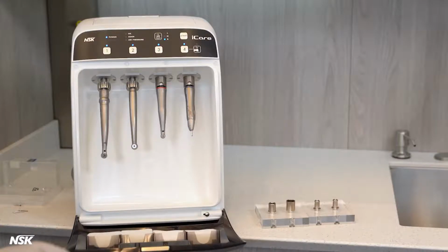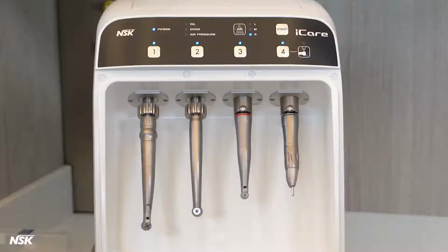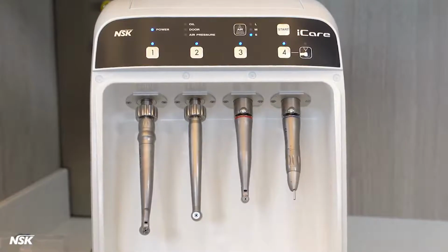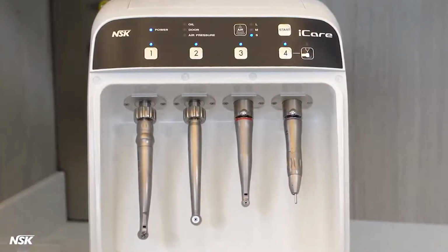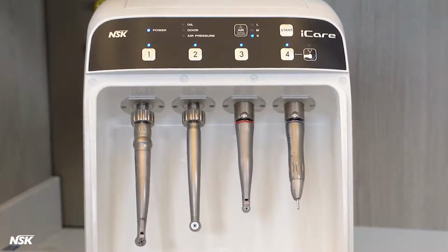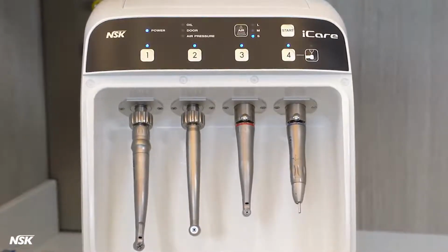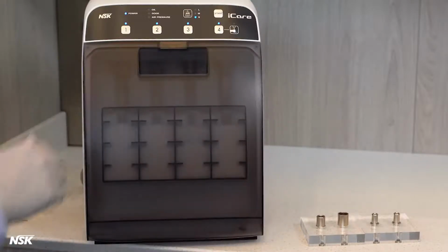Please note, you can run iCare with 1, 2, 3, or all 4 ports connected to handpieces. It is not necessary to use all 4 ports every time you lubricate. However, the operation time will be shorter if you have fewer handpieces connected. The average operation time is about 40 to 50 seconds per handpiece, depending on the type of the handpiece and air purging cycle chosen. To start the lubrication process, close the door and activate only the ports which have a handpiece connected.